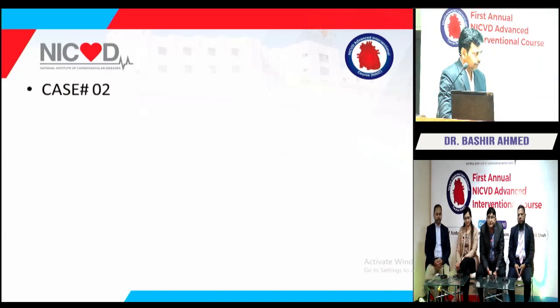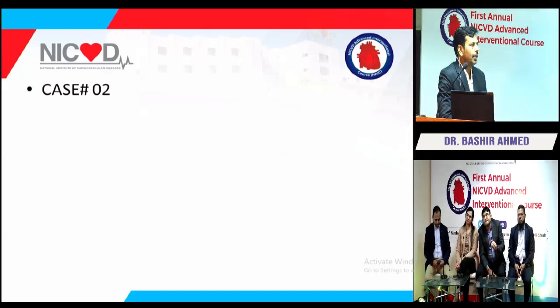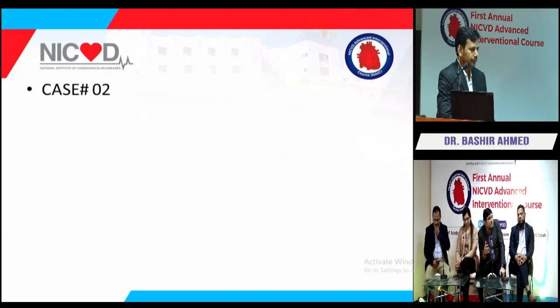Okay, can you guide us step by step? If there's burr entrapment, how will you manage it? For burr entrapment management, there are several ways to retrieve the burr. First of all, you should know the mechanism or reason the burr was entrapped. It may be because of coronary artery spasm.